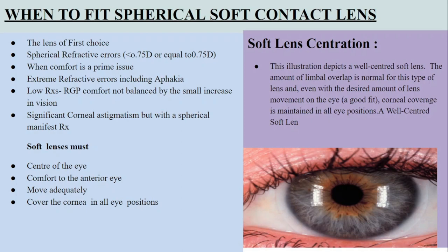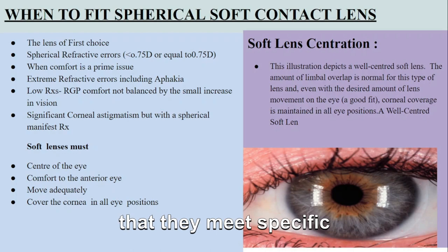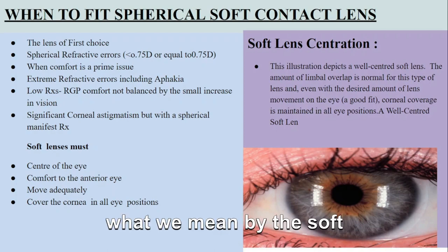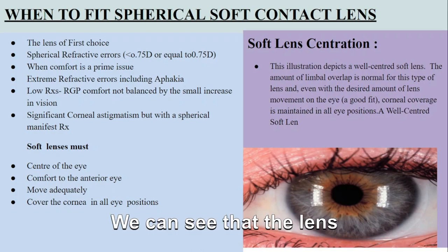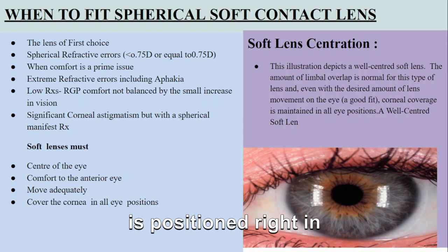When fitting spherical soft contact lenses, it is essential to ensure that they meet specific criteria for optimum performance. Let's take a closer look at what we mean by soft contact lens centration. Of a well-centered soft lens, we can see that the lens is positioned right in the middle of the eye.